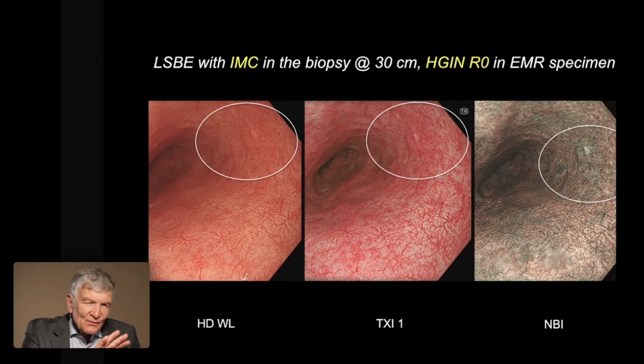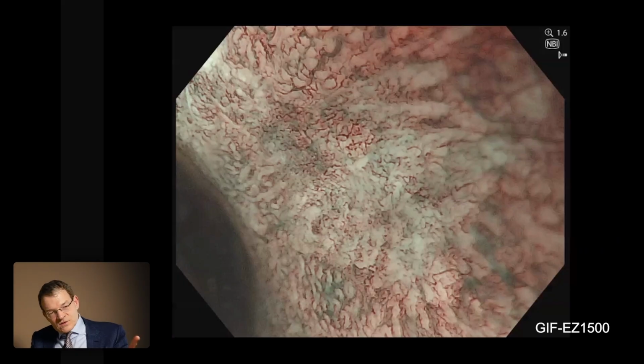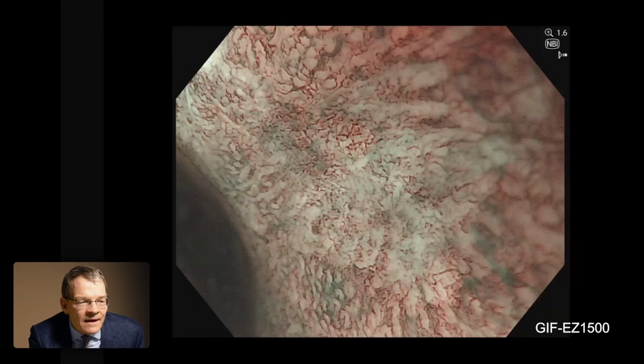But, you know, from left to right, everybody appreciates there are changes and there's probably more clarity. So here you see now this lesion. You can appreciate the whiteness of the scar, and you may also nicely appreciate these pathological capillaries, also corkscrew vessels which are blindly ending.